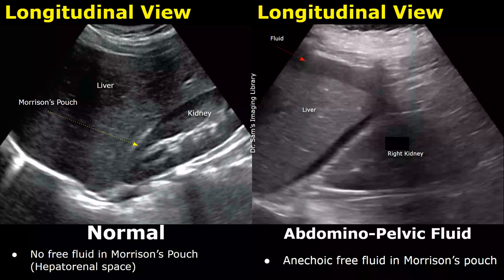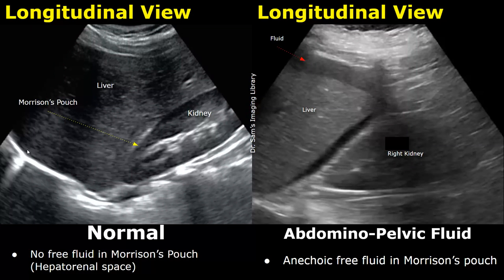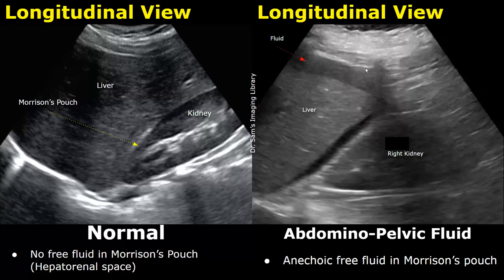Now we move down to the right upper quadrant to scan the space between the liver and the right kidney, which is called Morrison's pouch or the hepatorenal space. Normally, no anechoic free fluid will be seen between the liver and kidney in this longitudinal view. Here is an image of abdominal pelvic fluid in a patient with trauma.